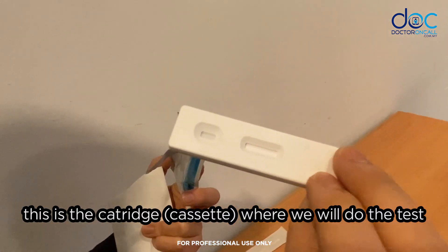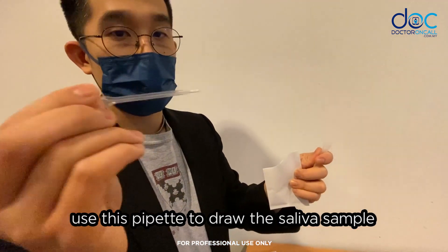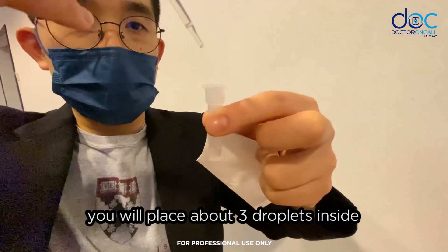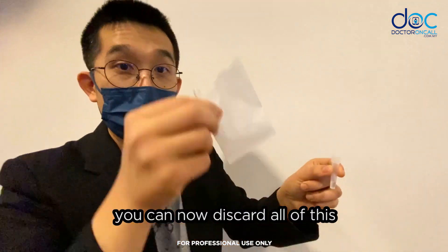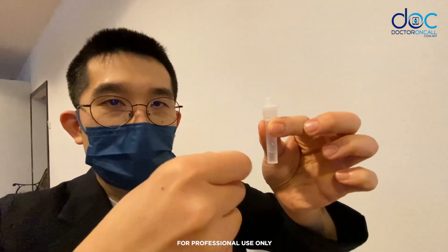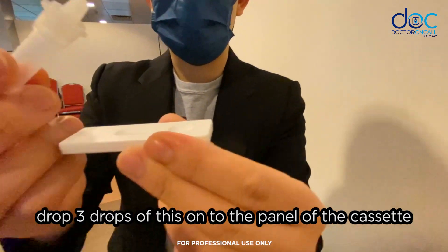Once the saliva is collected, we use this cartridge to do the test. Open the buffer solution, then use the pipette to draw the saliva sample. Place about three droplets inside — one, two, three. You can now discard the pipette and cup, cover the tube, and shake it a little bit.